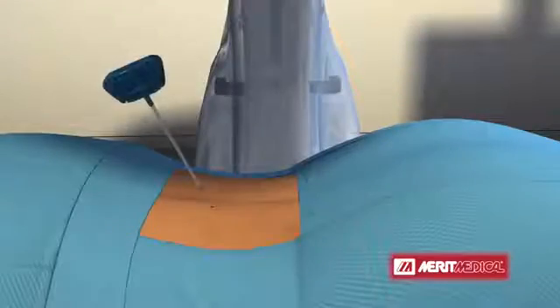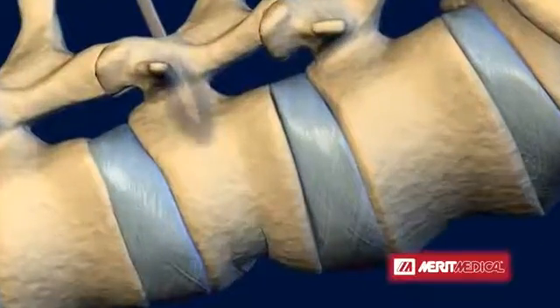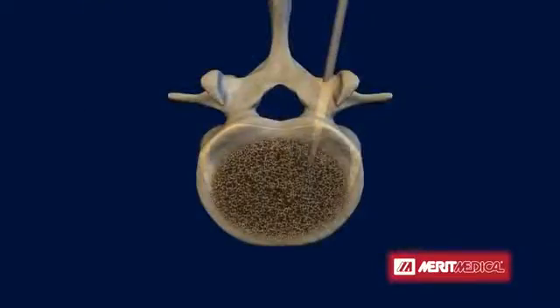The RF-TVA procedure begins with placement of the Stability introducer into the posterior one-third of the vertebral body.